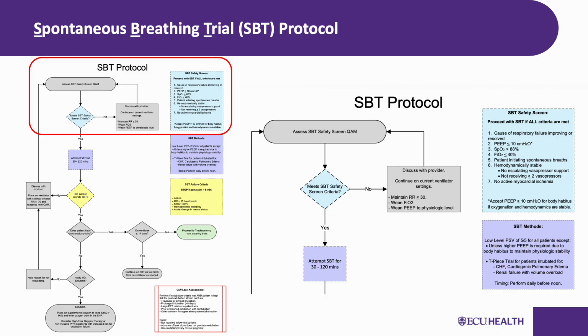And one thing I want to emphasize here is the timing. We want to perform this safety screen early in the morning before shift change if possible, so that if the patient is a candidate, we have the best possible window to conduct the SBT before noon. Starting early gives us time for the trial, time for an assessment after the trial, and time to coordinate extubation if the patient passes. Waiting until the afternoon to screen means we may lose that window and push liberation out another day. And every day on the ventilator is a day we are adding risk for the patient.